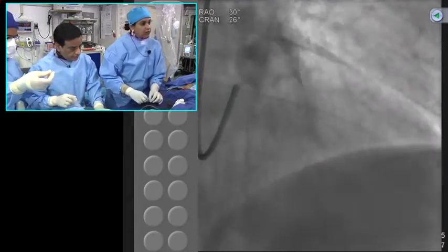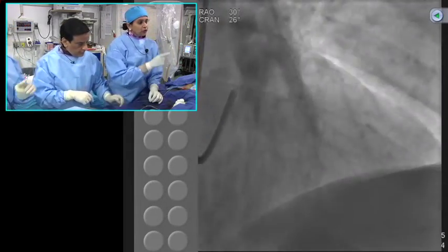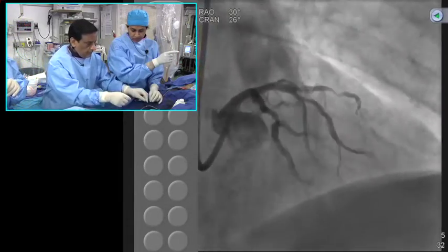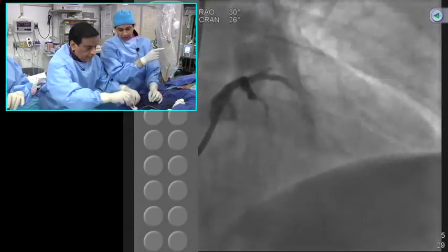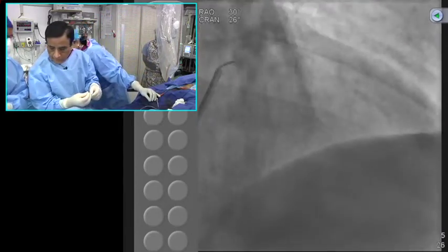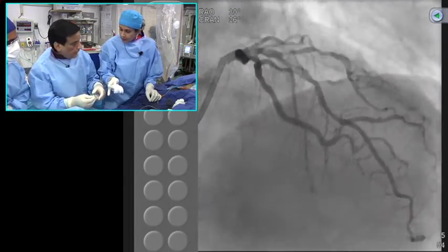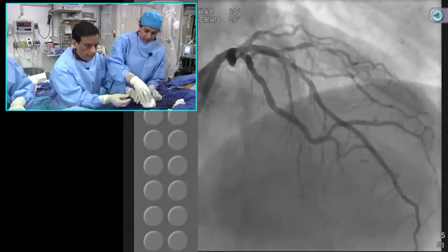I think the discussion we are having is the length of the LAD stent. So that's why we went to the first picture. There's very prominent bridging there in the mid portion. So never stent it, because once you wire it, you make it look like there's a lesion there. So 24, or something like 3.0 by 24. No, that's a no. This is 3.0 by 20. Yeah, for the LAD. Wire is in the LAD now.